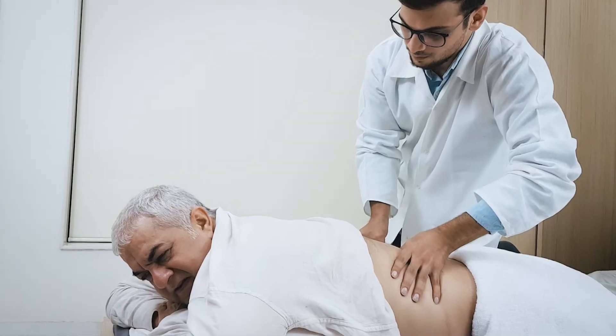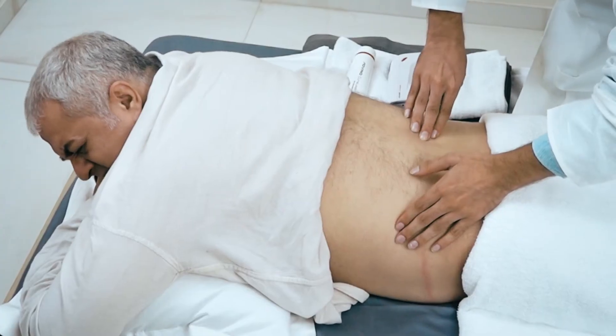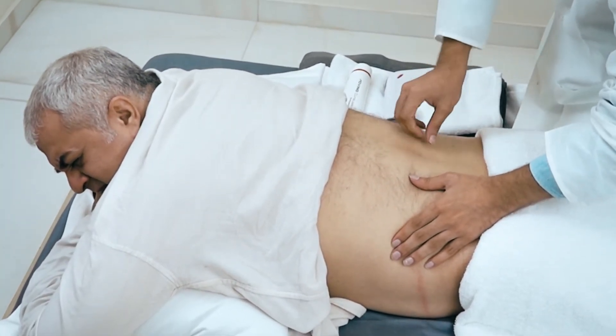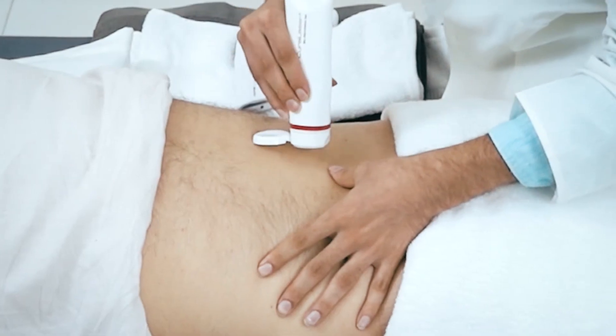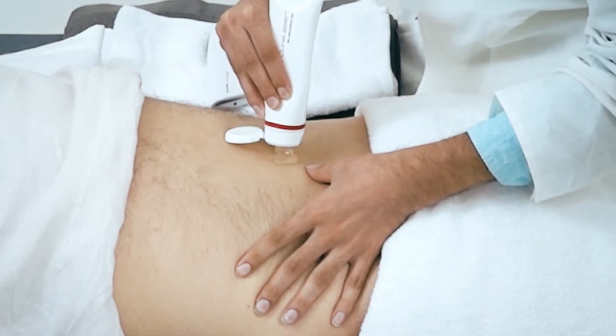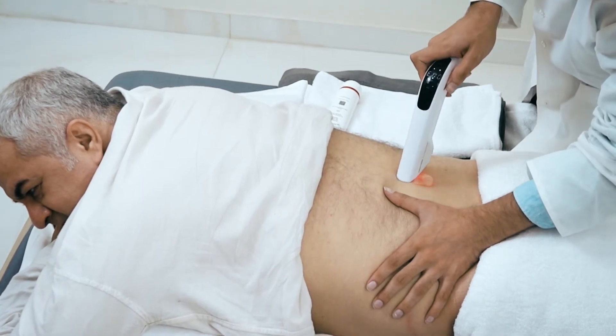Concentrate the treatment with Cura Laser over this area for optimum results. The surface area of the lower back is very large, so use the large therapeutic head to cover the whole area in a single treatment session. Apply a small amount of Cura Laser Biostimulation Gel either on the therapeutic head or over the lower back. Press the large switch to turn on the large therapeutic head.